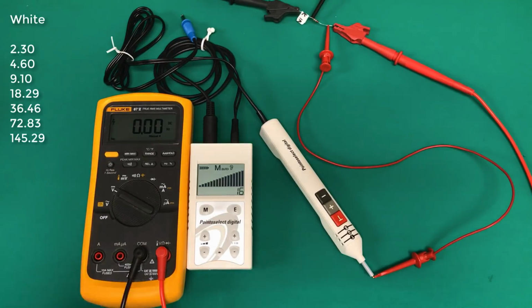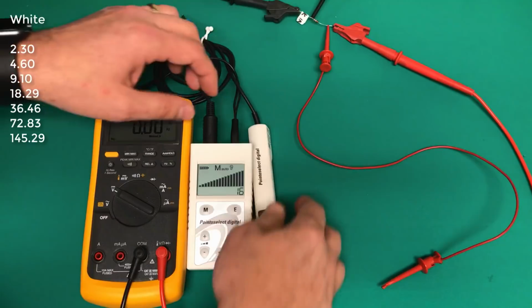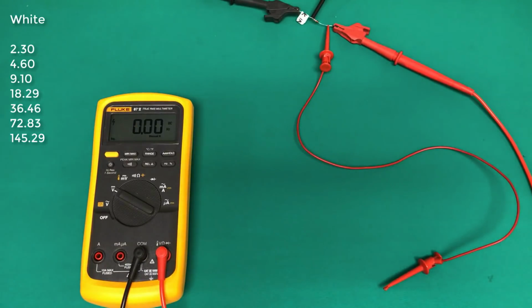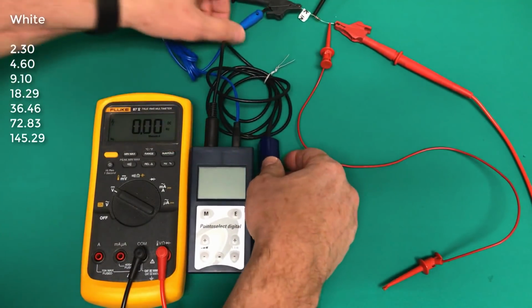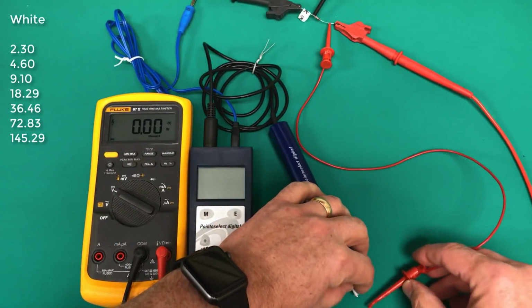Now, what I'm going to do, I've heard people making all kinds of claims and statements about how the blue version of this particular unit isn't accurate, or how it's made of inferior quality or inferior materials. I've heard all kinds of things. And I want to test, and I'm going to leave the camera running so you can see there's no editing going on, no funny business at all. I'm just going to set this right where the other one was. We're going to hook it up, and I want to test them head to head.